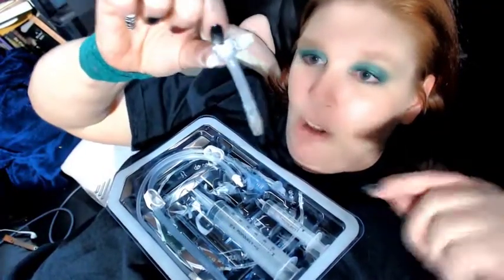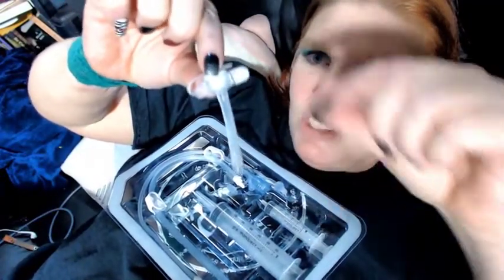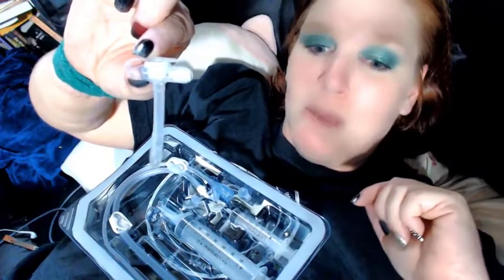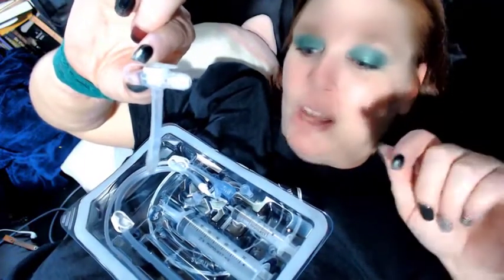Go ahead and take a look at this stuff. So this part is the tube itself. This is the part that goes into my stomach, and all you see is this part sticking out. I hope you can hear me. I forgot to move my microphone. My microphone is like across the room. I'll try to speak up.